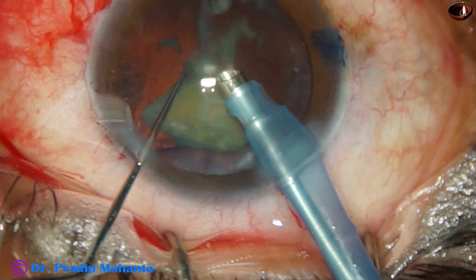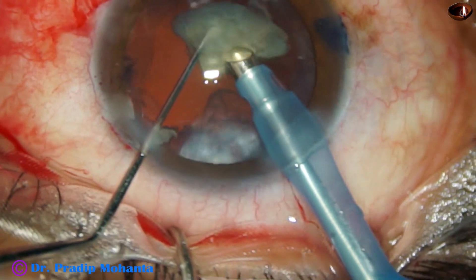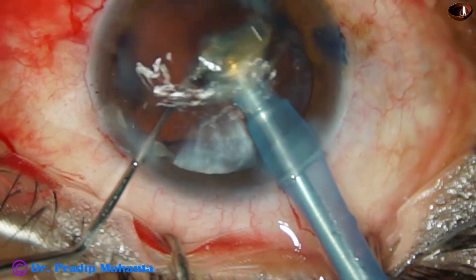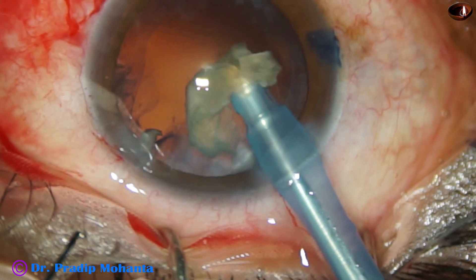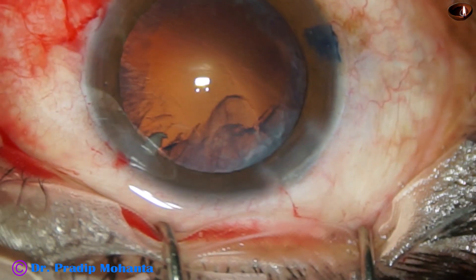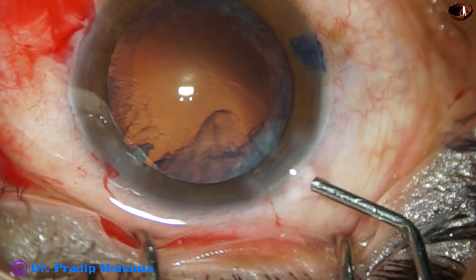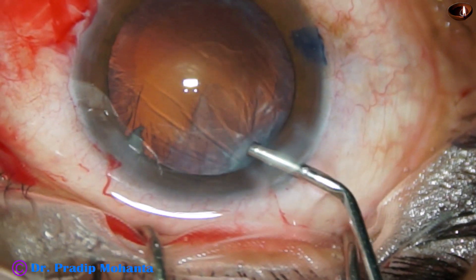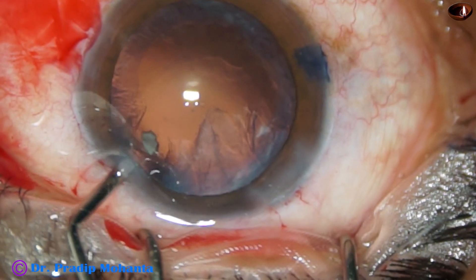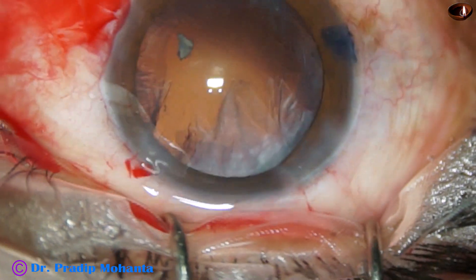But if the nucleus is brown or hard, I will not try to proceed with phaco. Even if the patient is posted for a premium IOL, I will convert to SICS and place the premium IOL, opposing the conjunctiva nicely with releasable sutures.